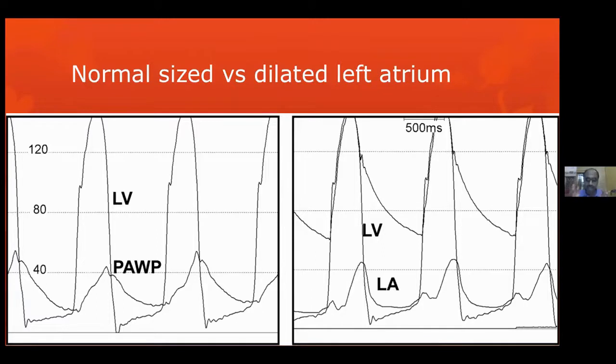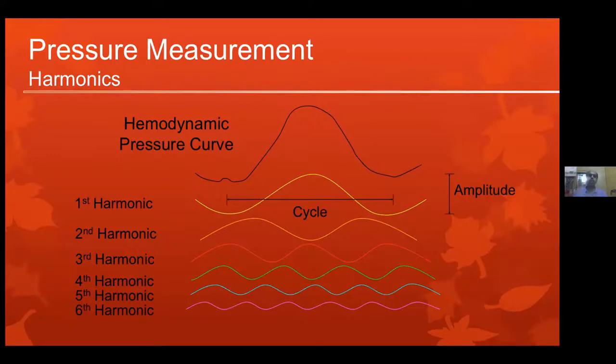So in other words, it is the force per unit area. So pressure is dependent on the chamber's dimensions. Now coming back to pressure measurement. I told that a heart rate at around 60 per minute can be called 1 Hertz. There is a question from another person: why in bicuspid aortic valve no pressure recovery?